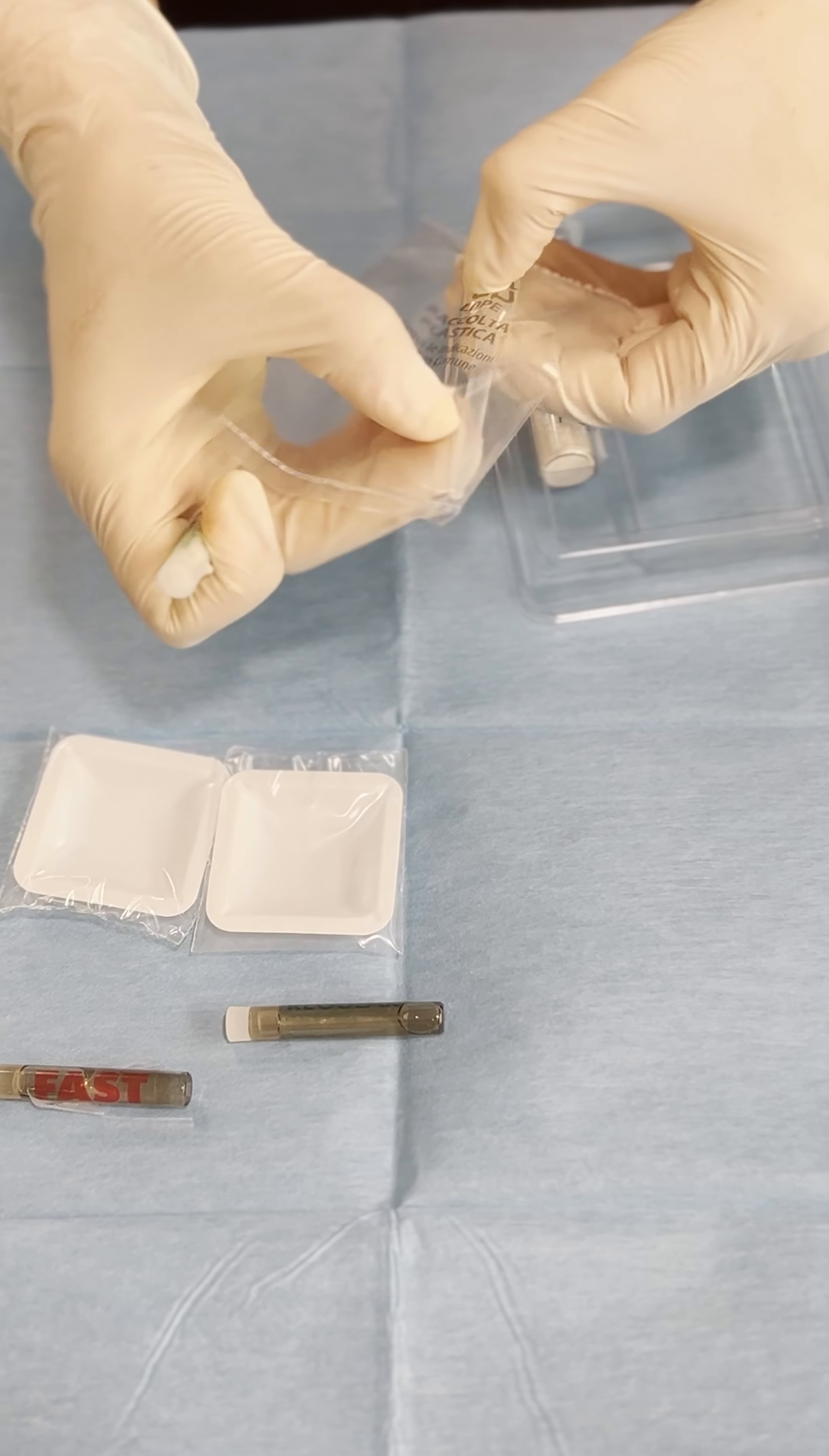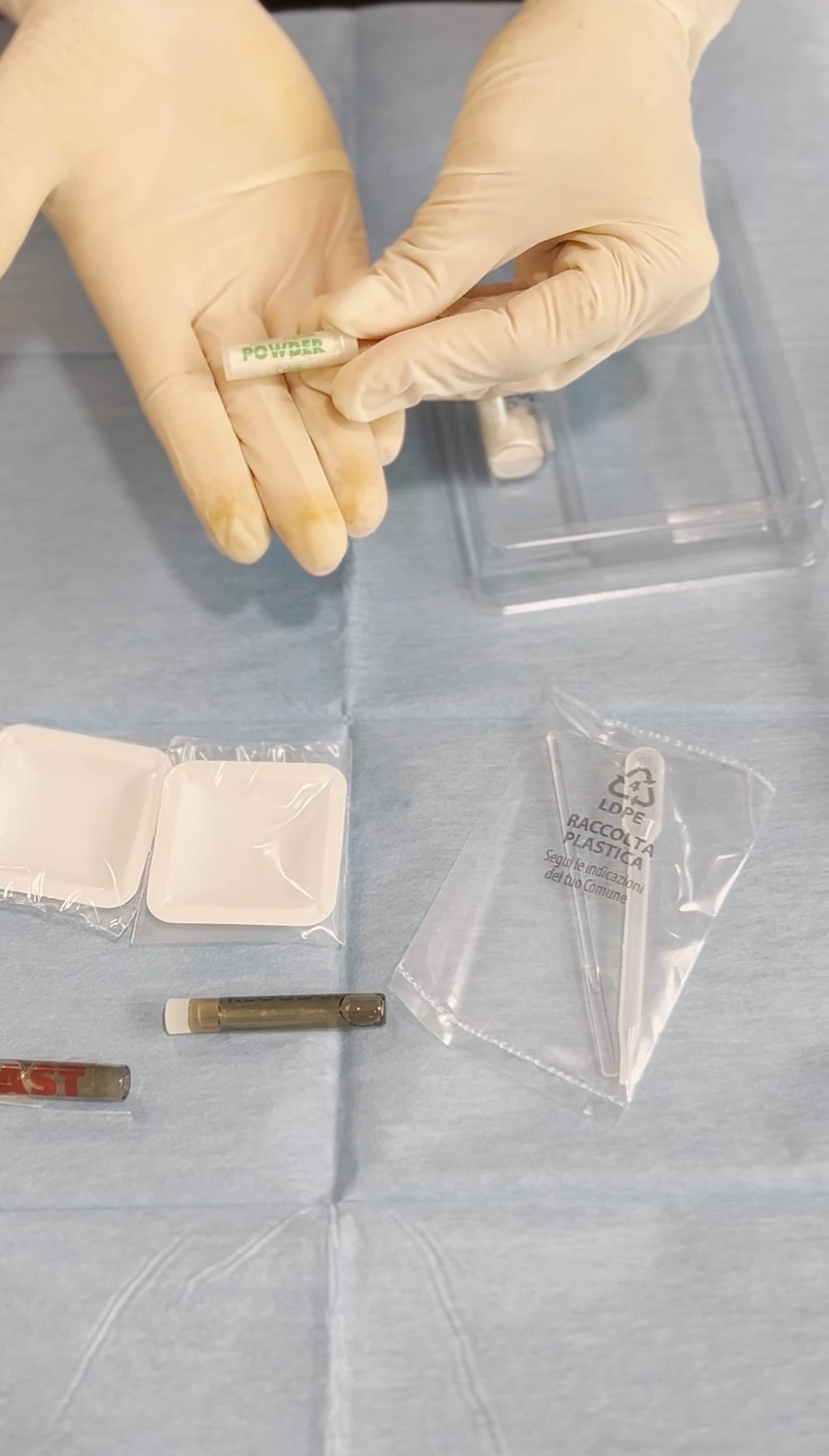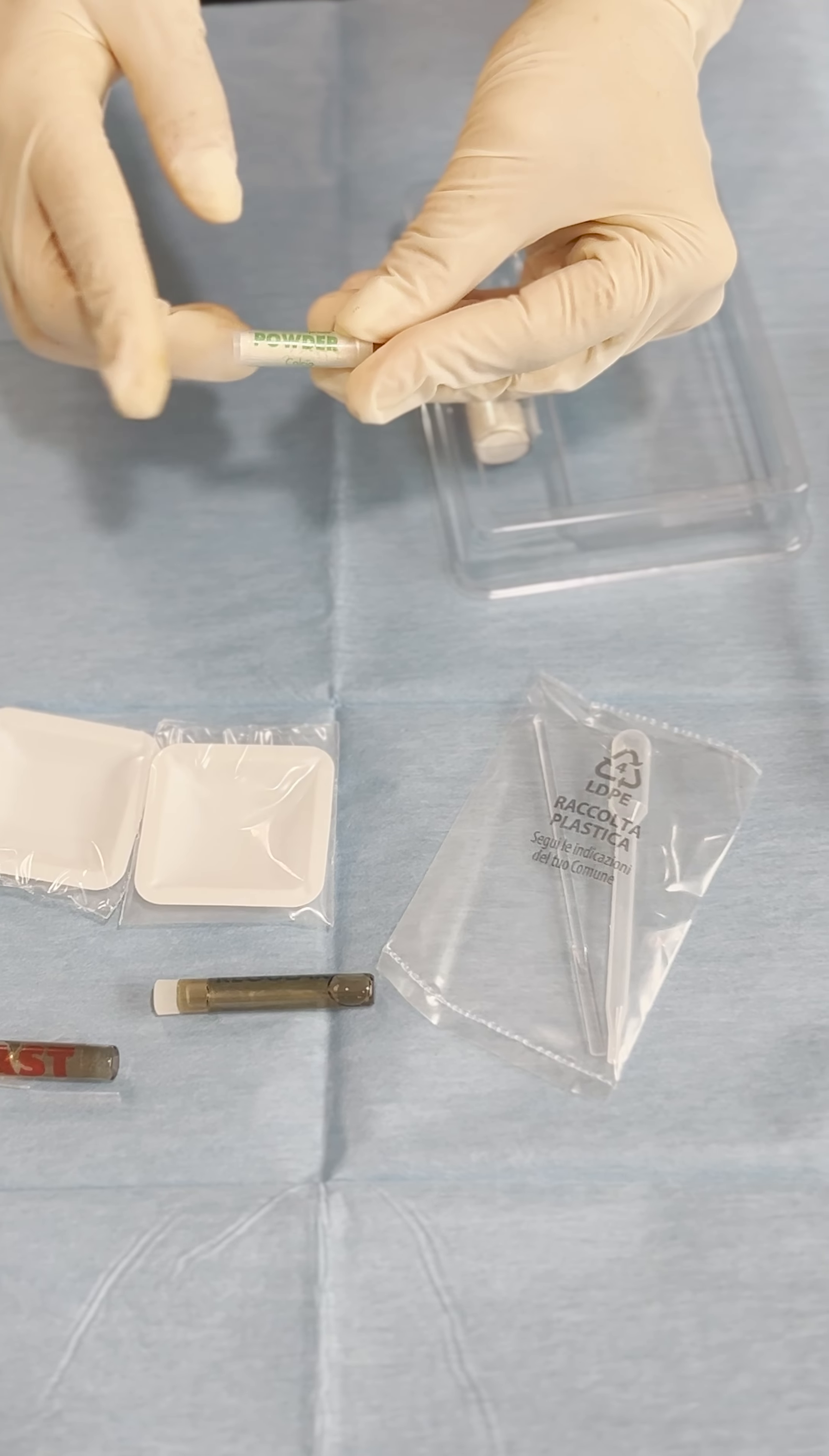Then here we have the mixing pipes and here we have hemihydrate calcium sulfate powder that we can use as a membrane on top of the defect and we can also use it during our apicoectomy in the bone crypts in order to have the bleeding under control and do our apicoectomy right.